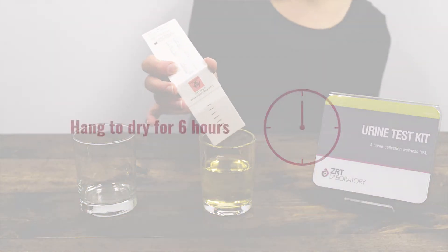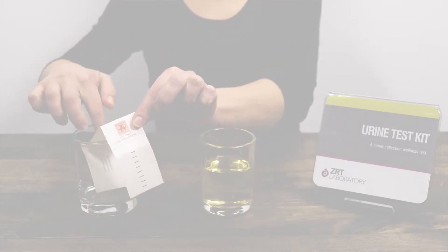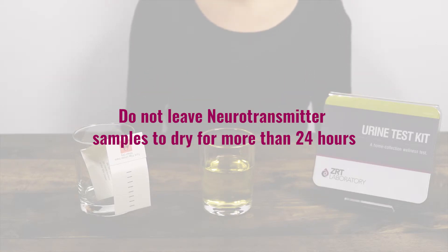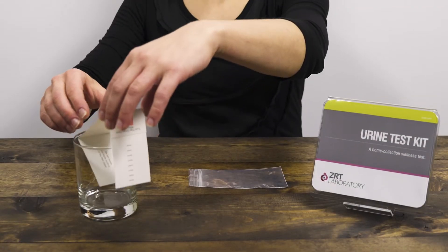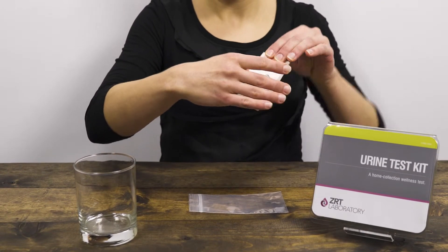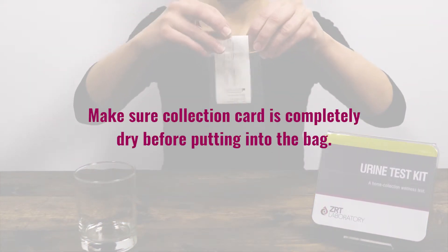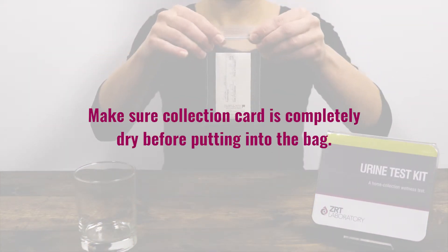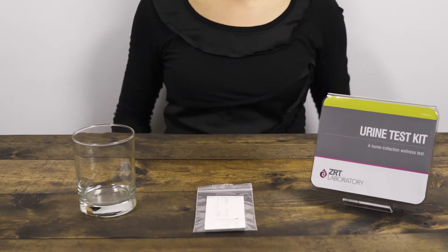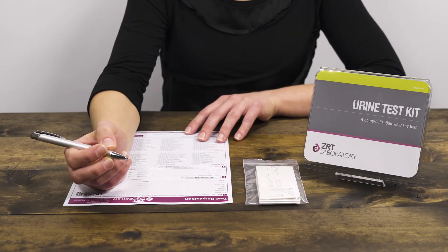Hang to dry for at least six hours with the cover folded back and away from the filter paper. For neurotransmitter tests, do not leave samples out for more than 24 hours. Once your sample is dry, carefully refold the collection card and place it back into the plastic bag. Make sure your collection card is completely dry, as samples that are still wet may be rejected by the lab. If your kit came with an absorbent pouch, make sure to keep it in the bag. Follow this process with the remaining collection cards.